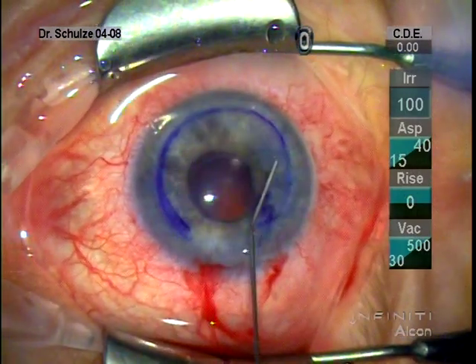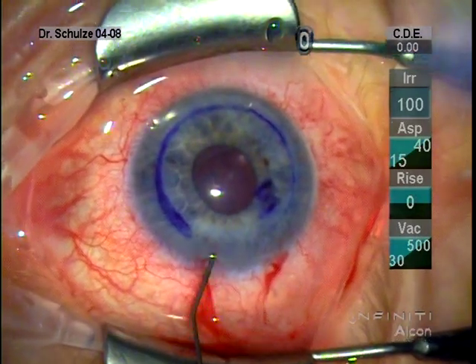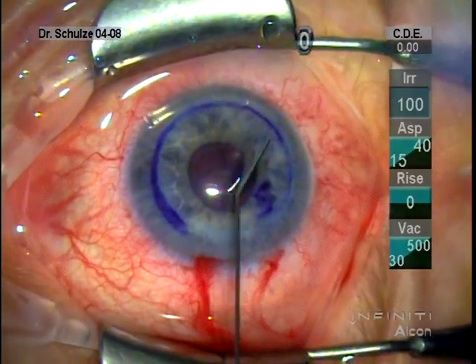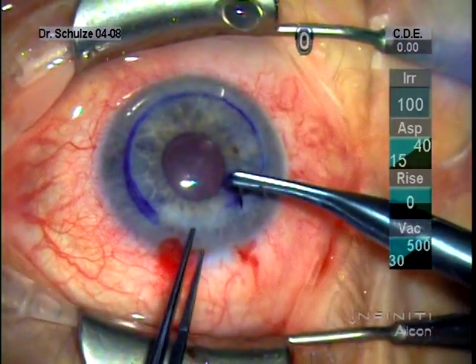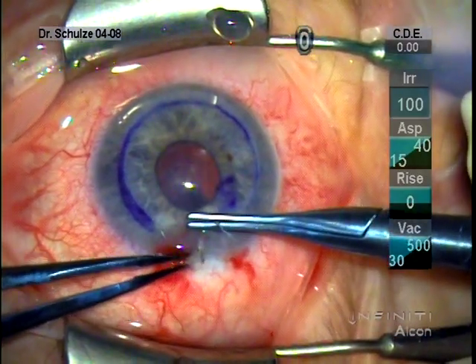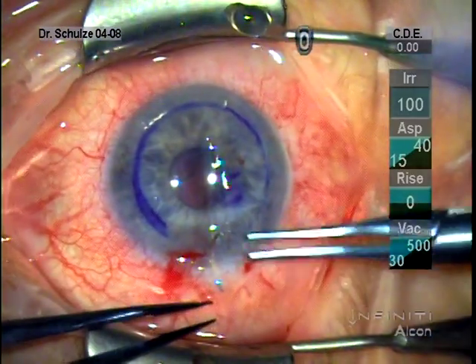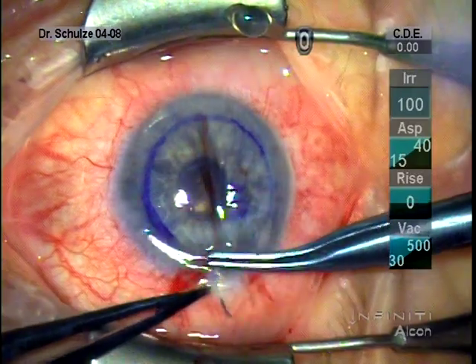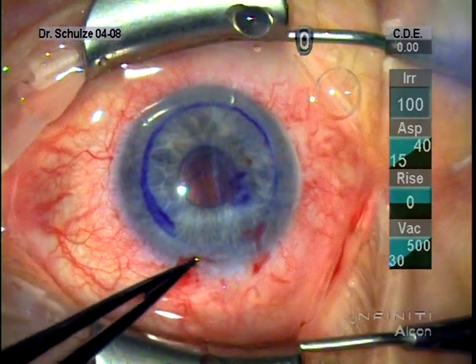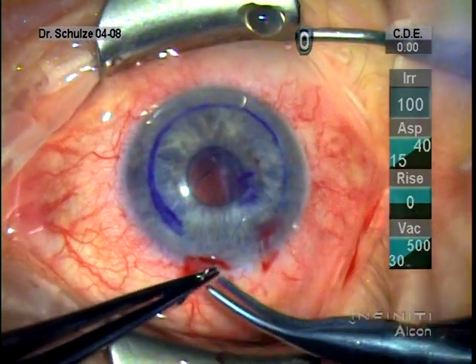Having placed the donor, we've formed up the anterior chamber and I typically like to suture the wound with a 10-0 vicryl. In this case I just use a little X suture with a buried knot, although of course you can do interrupted sutures, or in some cases — particularly if you have a self-sealing scleral tunnel — you can do these cases without a suture. Here we did in fact suture the wound with a little X and a buried knot.